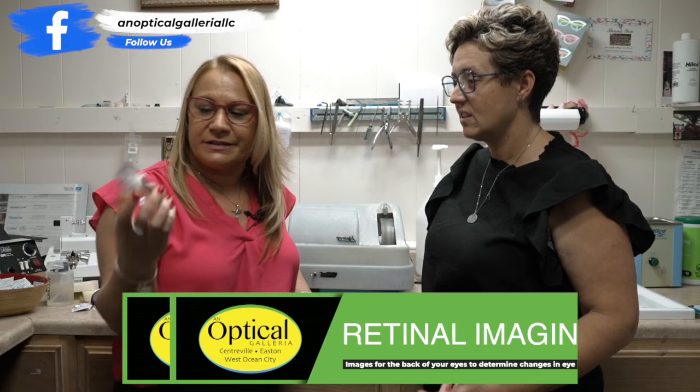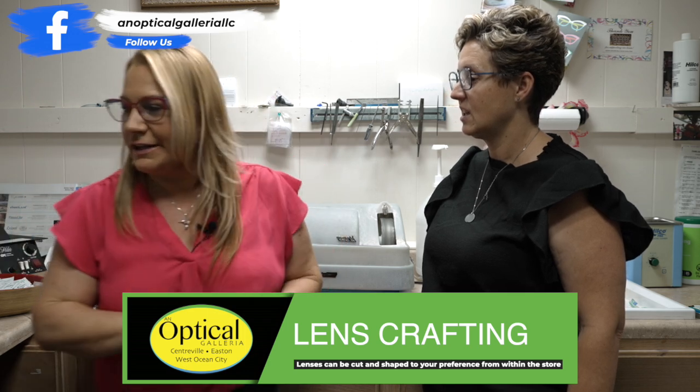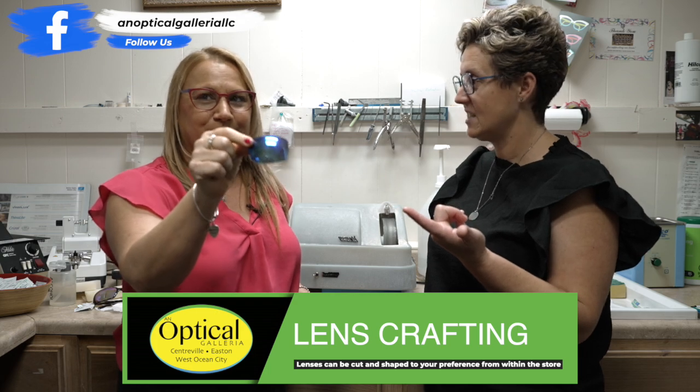So this is the way your lenses start and then we cut them down, edge them in the edger and they can turn out like this. Like that. Yep. So that's pretty cool.